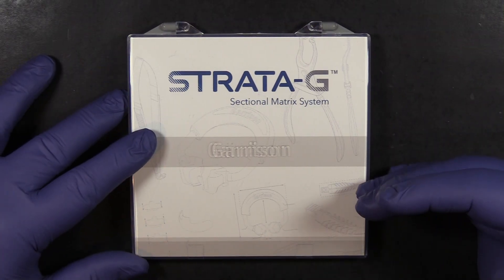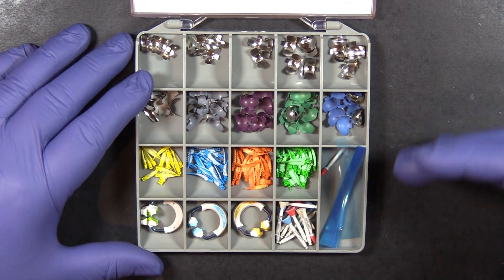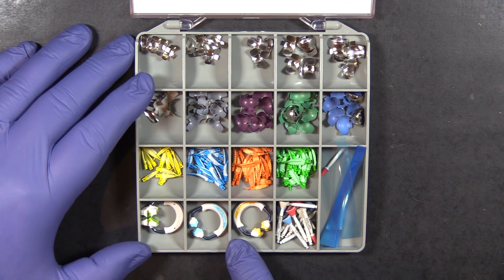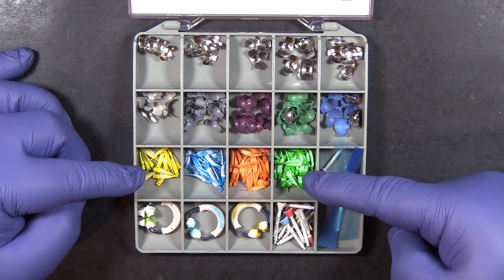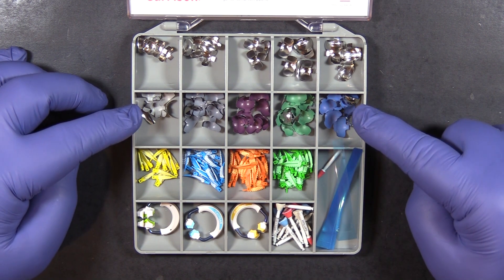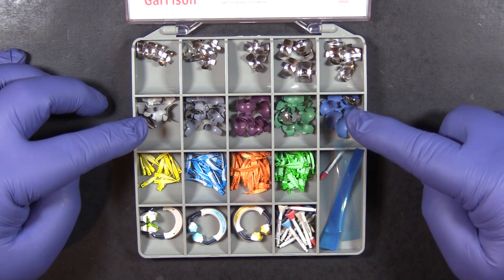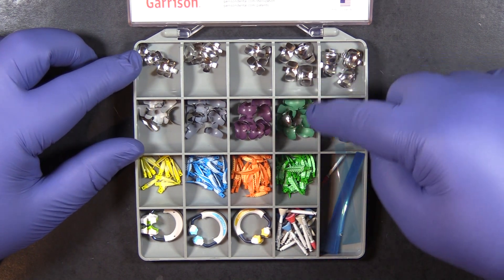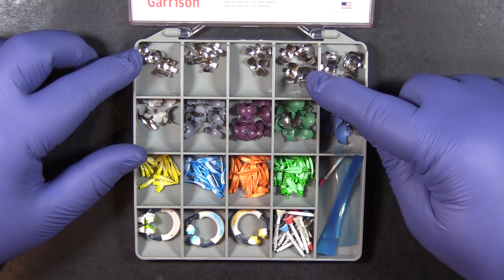Let's talk about the sectional matrix individual kit components. You may not have this particular version, but they are generally set up very similarly. You'll have a selection of separator rings designed for specific locations in the mouth, and a selection of wedges — still a critical part of the equation. There are different sizes of matrix bands. The color-coded ones are non-stick dead soft matrix bands, while the plain metal ones at the top of the kit are the same thickness but a different, much stiffer type of metal.